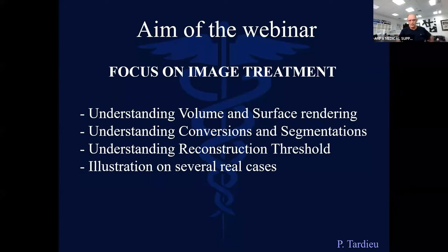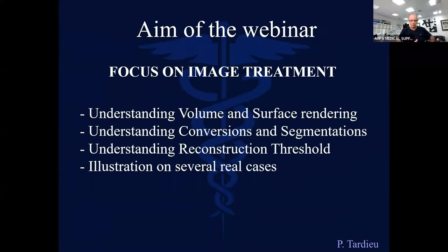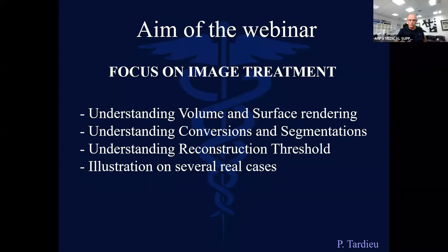We will spend some time understanding what is a reconstruction threshold. A CBCT or scanner giving you a DICOM will not give you just one kind of image — you will have an infinity of 3D images starting from the same 2D data. This is based on layer-by-layer reconstruction or threshold reconstruction, and we are going to focus on threshold reconstruction using real cases done by Arshad.